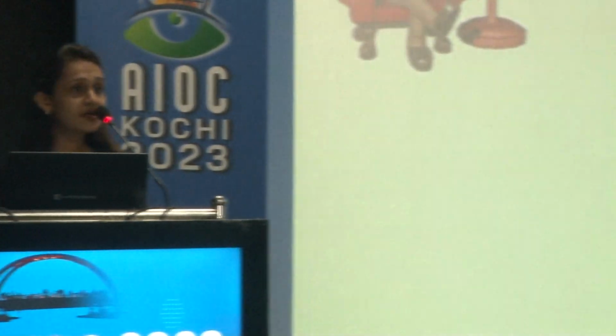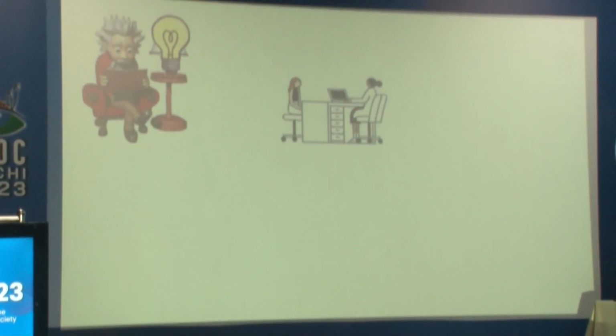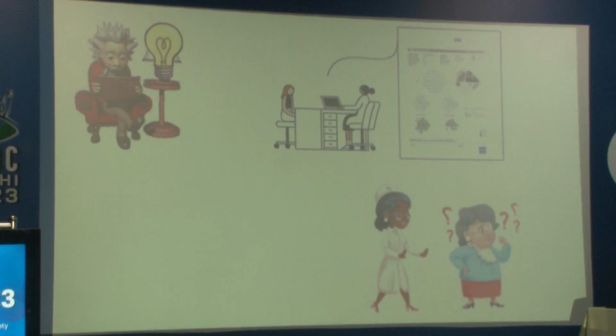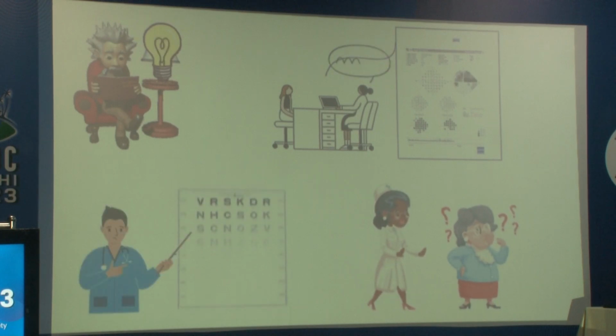Myself, Dr. Fatema Noble. I'll be presenting on assessment of contrast sensitivity by Spaeth-Richmond contrast sensitivity test in glaucoma patients. As we all know, glaucoma patients describe their visual compromise as blurring of vision and needing more light to perform any task. While a glaucoma specialist will equate these changes with the visual field printout while communicating with the patient, the patient is confused, unable to correlate between vision and vision-related quality of life. Hence, the glaucoma specialist should include contrast sensitivity assessment for glaucoma assessment.